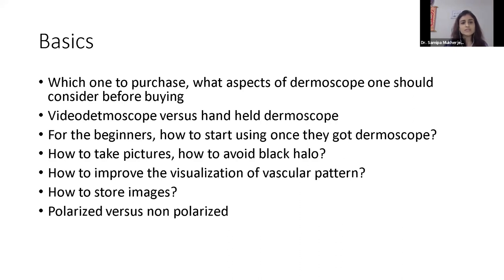And it is always a good idea to have both the modes captured, because in case you have missed out on a certain feature, you can retrospectively go back and check that and learn from it as well. So I personally prefer capturing the images of any lesion, it doesn't matter which one, in both the modes, non-polarized as well as the polarized mode.